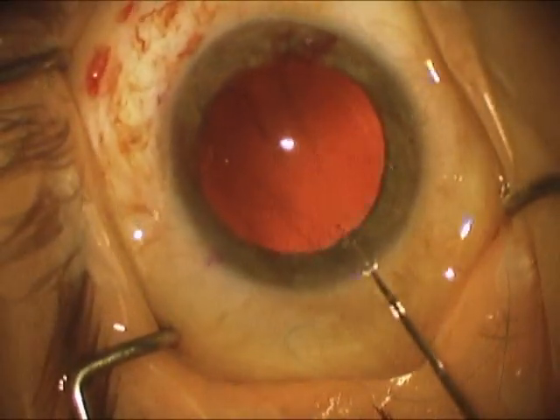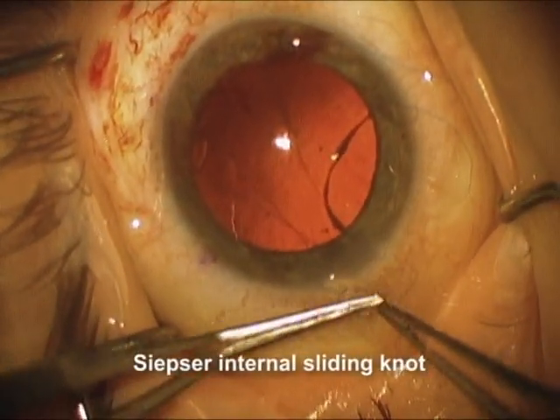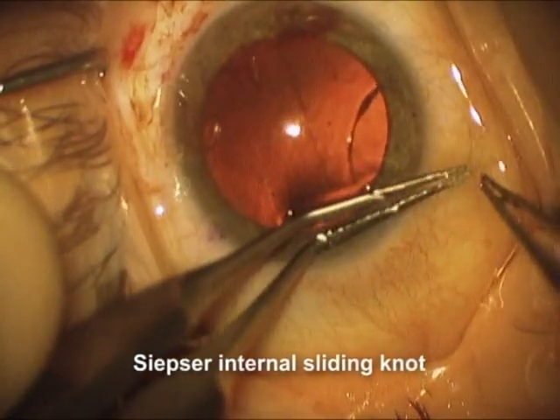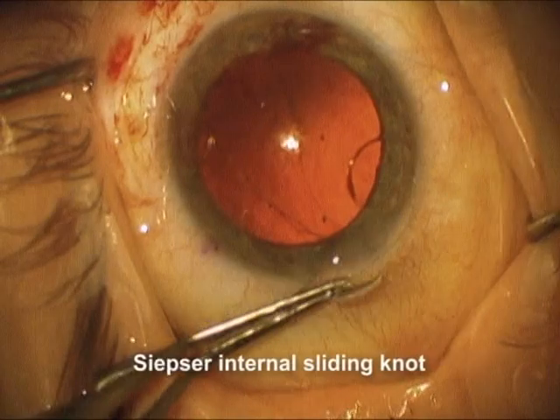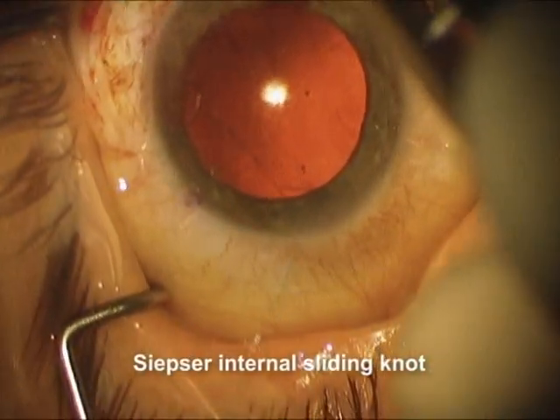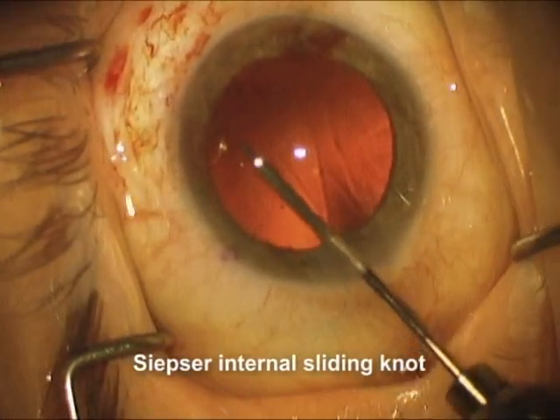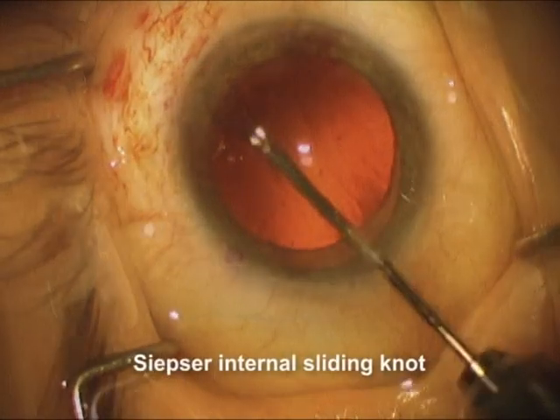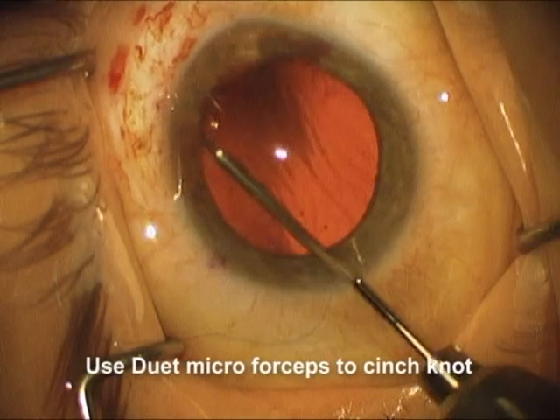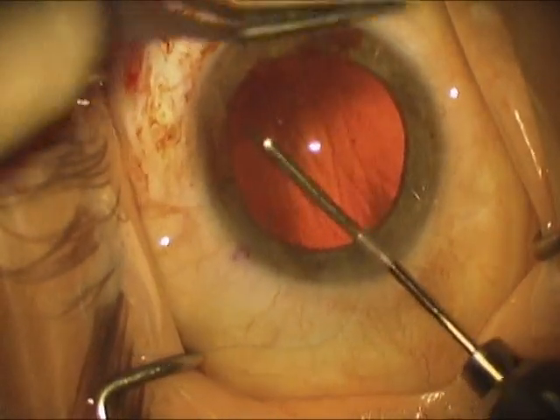Now the suture goes through the islet and then out through the wound with the free end. We've pulled a loop out, and just like Sipser showed us with iris repair, we can set up the knot outside the eye. Then by pulling on both of the free ends, we can pull the knot inside the eye. But we're not quite done yet because the knot needs to be slipped back and cinched down some. Here we're going to use the duet micro forceps to cinch the knot further down, which will bring the islet over towards the sulcus and tighten it up nicely.